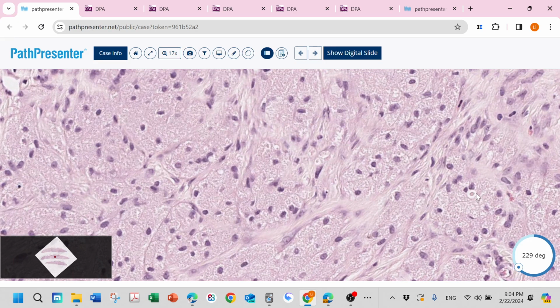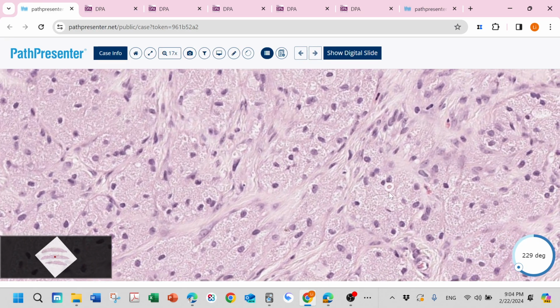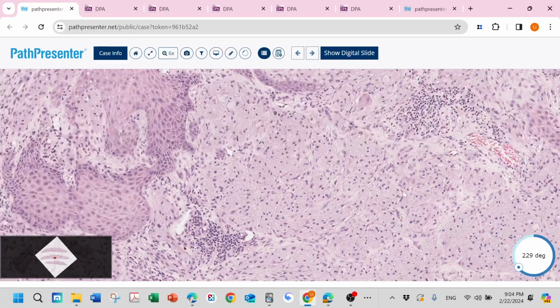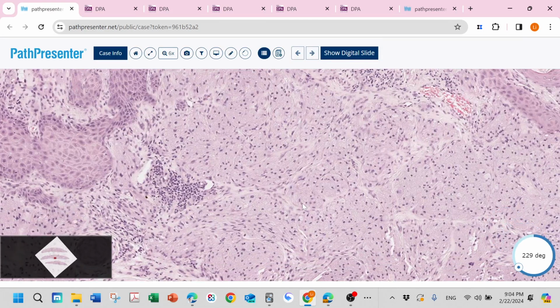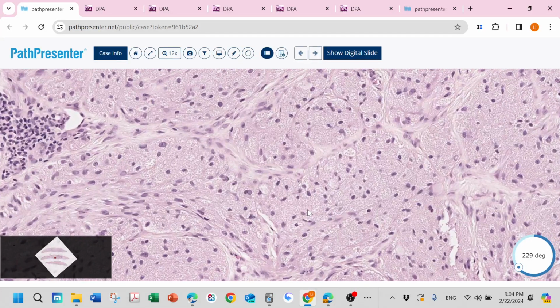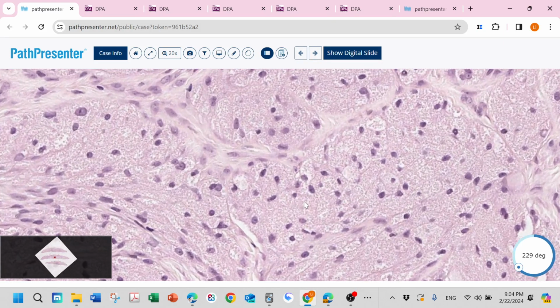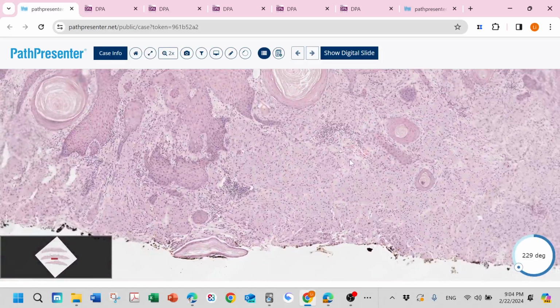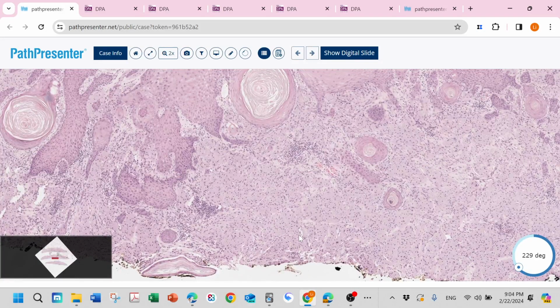And then we can see this eosinophilic inclusion. The buzzword is pustulo-ovoid body of Milian. So when you see this population with syncytial growth, that means you cannot find where one cell starts and another ends, as their cytoplasm just merges together. Syncytial growth with this granular cytoplasm, a really homogeneous growth in the dermis.